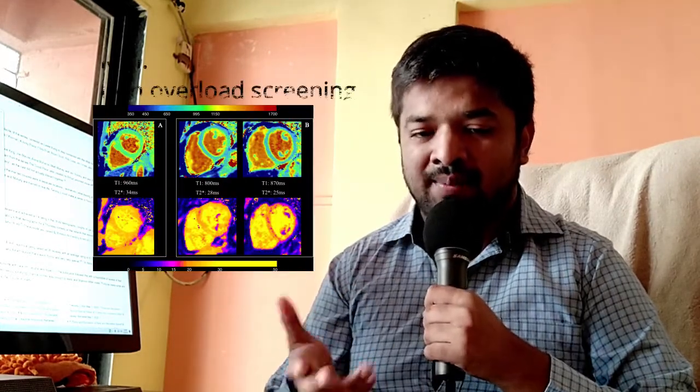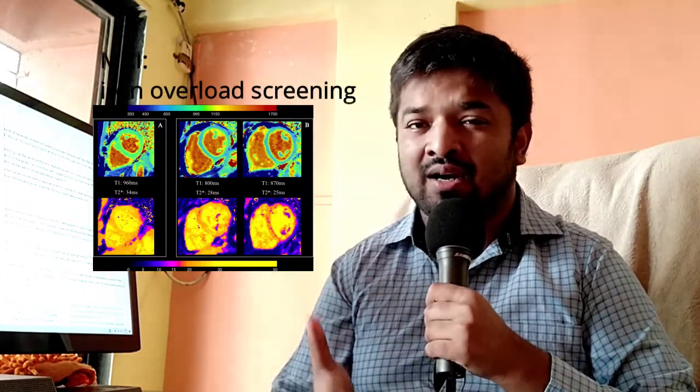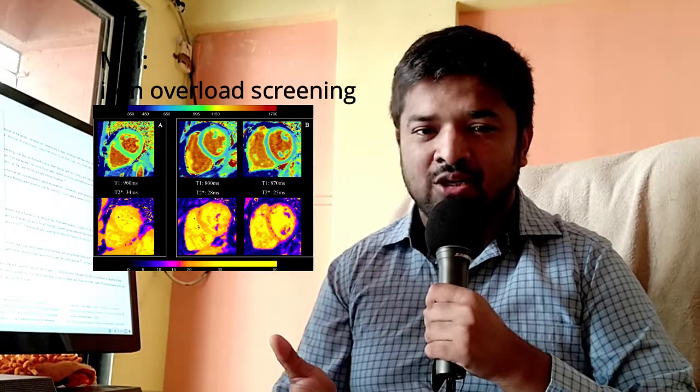Now, as I'm discussing that, I also want to touch on some niche topics. For example, iron overload. You have patients who have thalassemia and who need frequent transfusions. In those patients, you have a risk of iron overload, and T2 star imaging using MRI to see the iron overload in the heart, in the liver, and in visceral organs like the pancreas would be very, very useful.